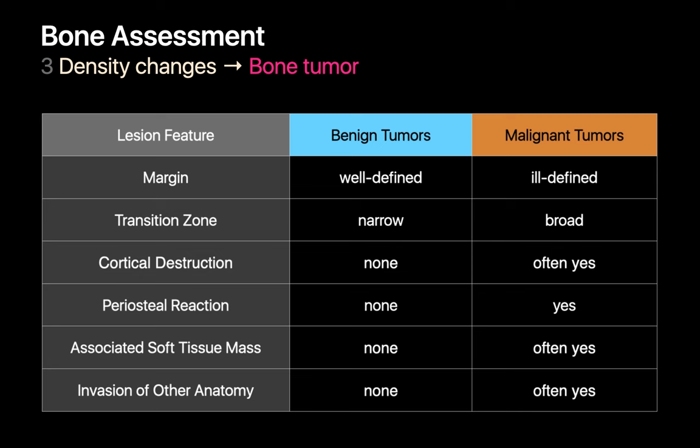Also notice the subtle cortical destruction near the tip of the blue arrow and the pathologic fracture near the tip of the red arrow. With malignant bone tumors, metastatic disease to bone is much more common than malignant primary bone tumors. Lymphoma and prostate cancer metastases to bone are generally sclerotic, while melanoma and renal cell carcinoma metastases to bone tend to be lytic. Lung, breast, and thyroid cancer metastases to bone often may be both.